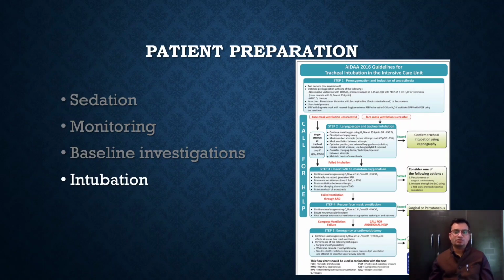Intubate the trachea using a proper checklist of intubation as advised by standard guidelines such as AIDAA, that is All India Difficult Airway Association 2016 guidelines, which are unique guidelines, first of its kind for tracheal intubation in ICU.